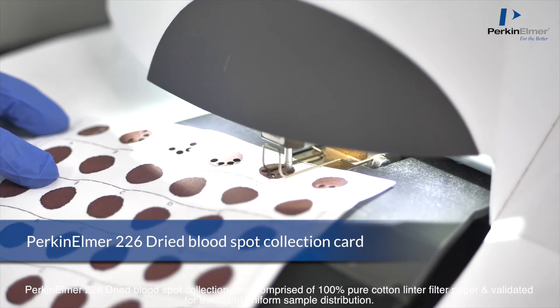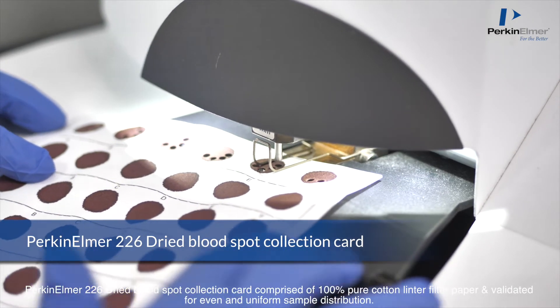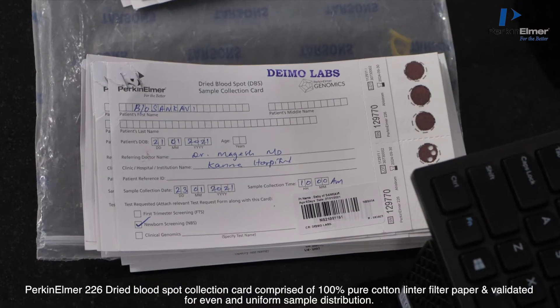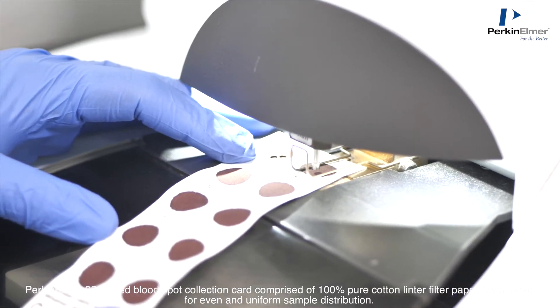The PerkinElmer 226 Dried Blood Spot Collection Card comprises 100% pure cotton linter filter paper and is validated for even and uniform sample distribution.